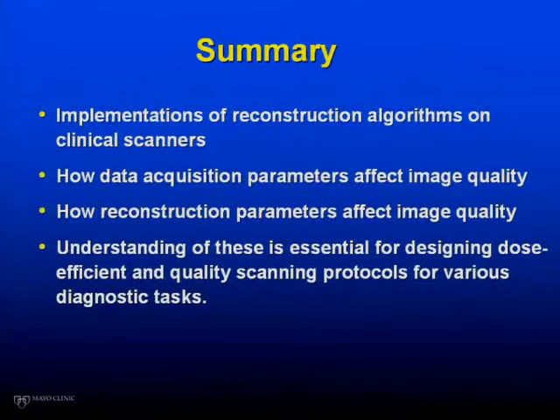In tube current modulation or kV modulation, do you know if the manufacturers change the focal spot size? And if they do, have you looked at the effect this might have on spatial resolution? Oh, that's a very good question. I heard that the lower kV has a slightly increased focal spot size, and we were trying to quantify that, but it is very subtle. By measuring the MTF, I don't see a significant decrease of the spatial resolution.